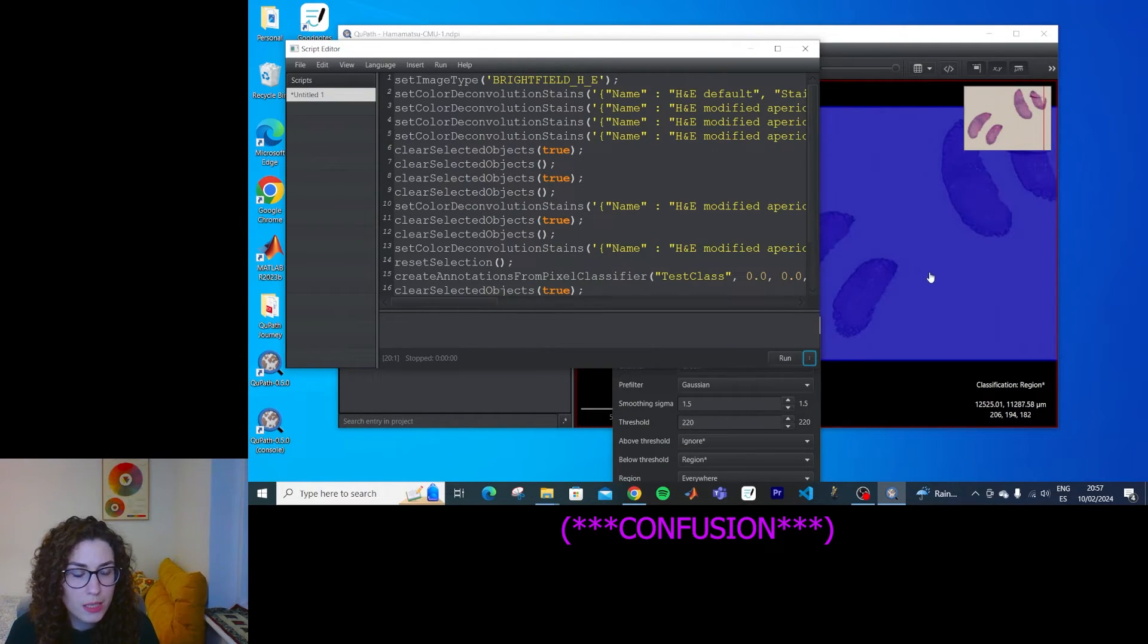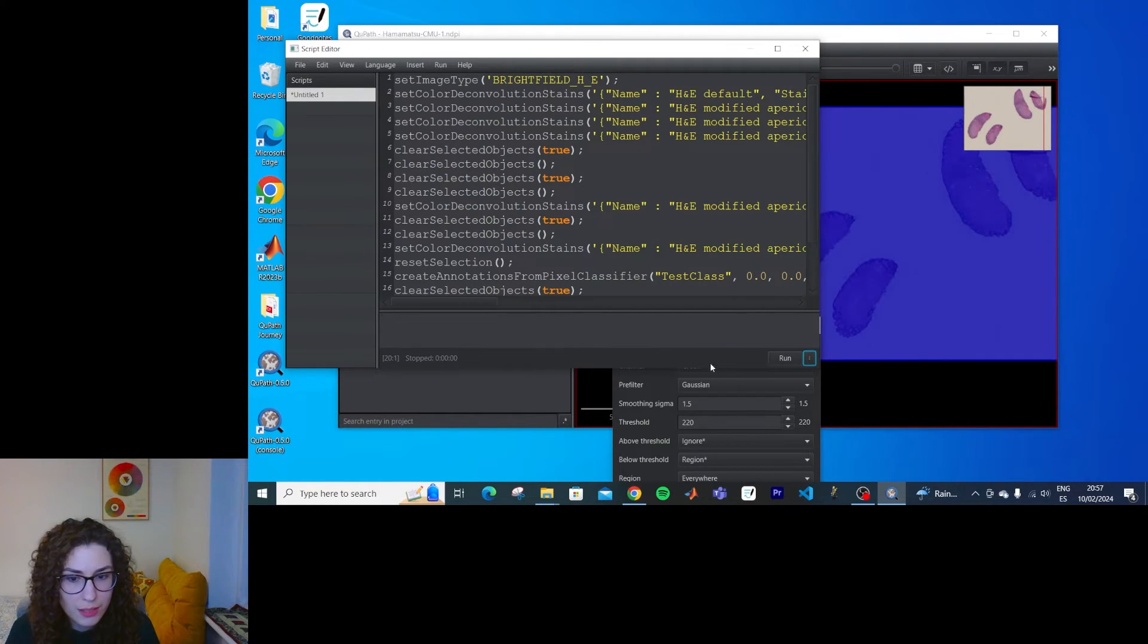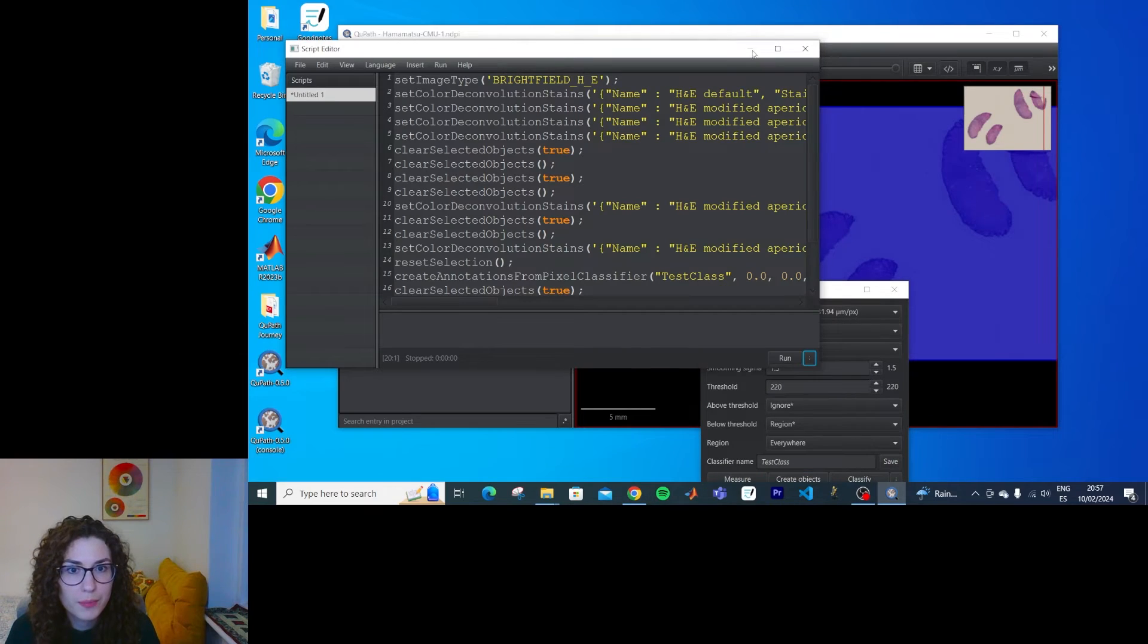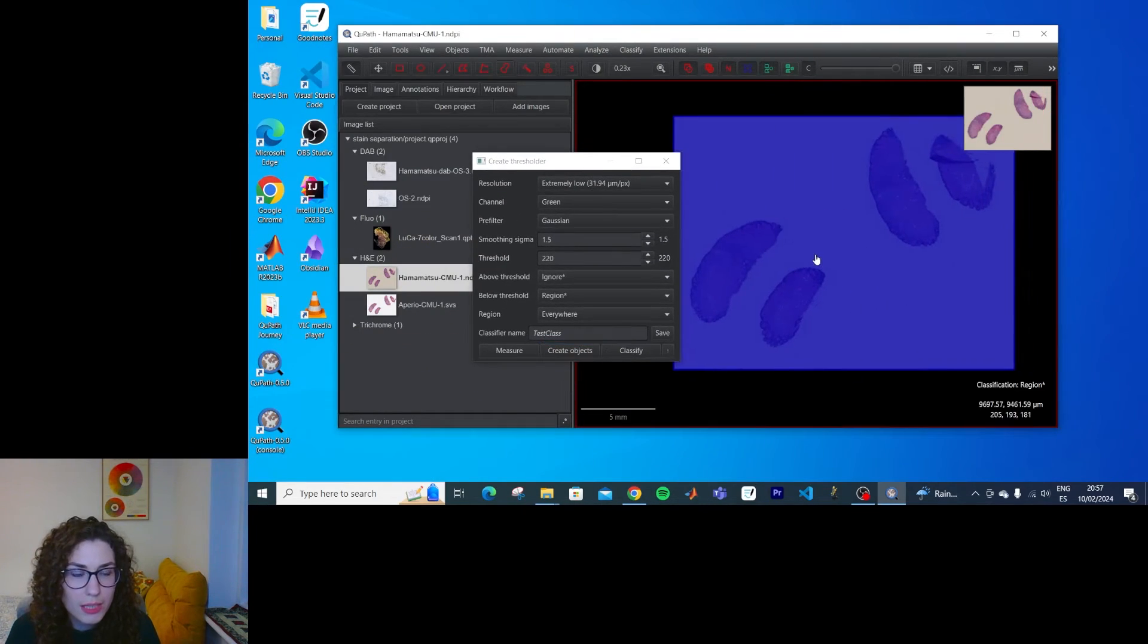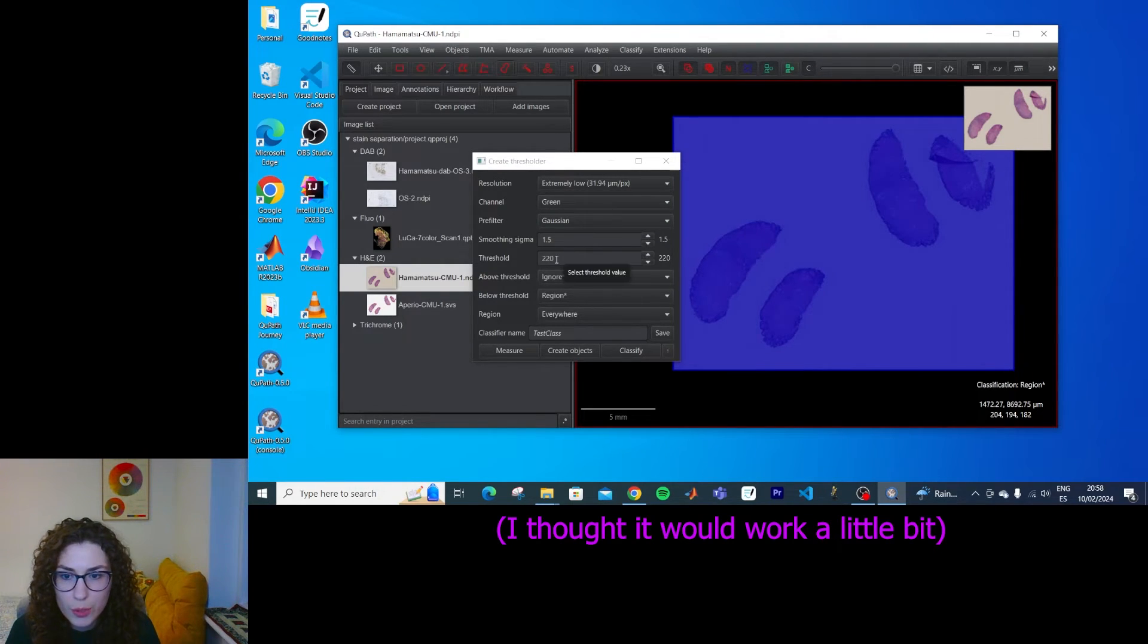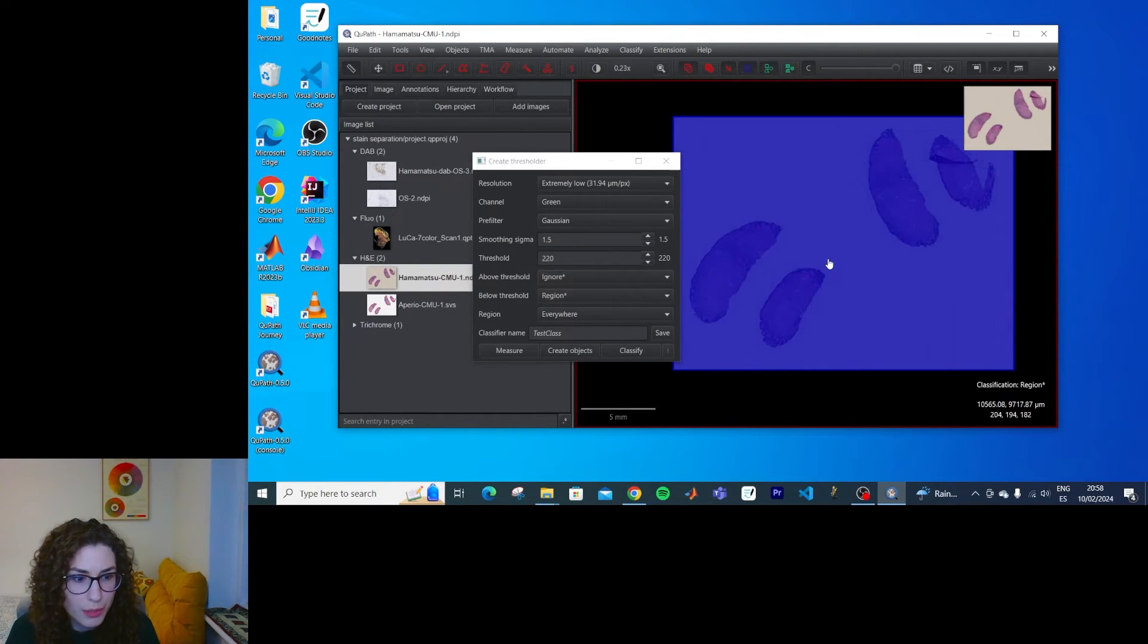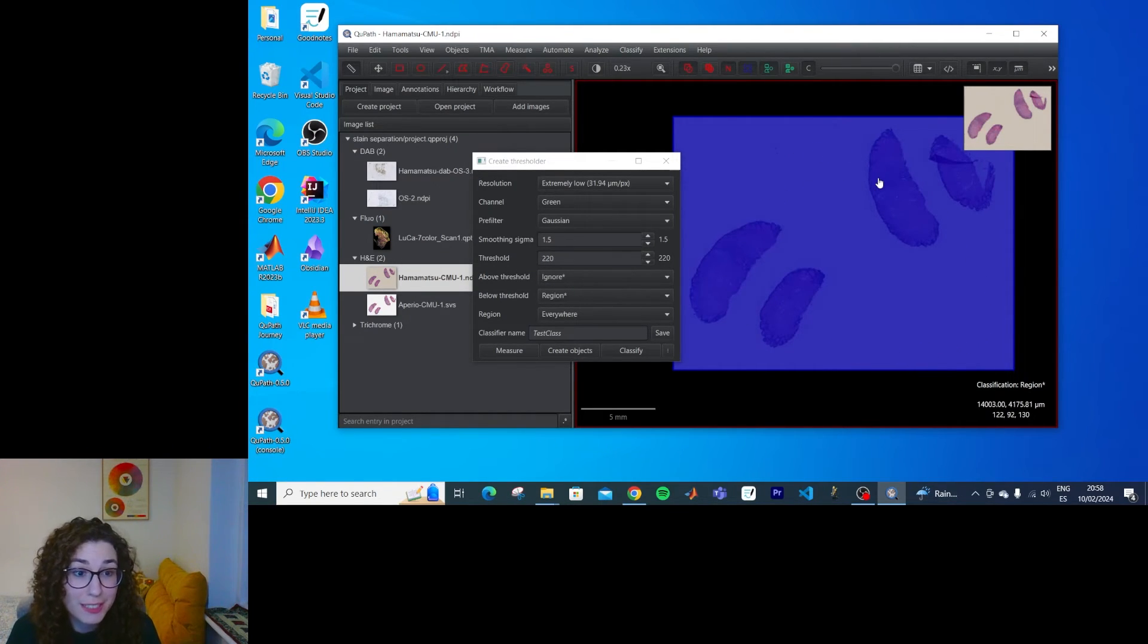And it doesn't work. It doesn't work because I said that doesn't work because I'm saying that the threshold is with the green and 220 value. And region is whatever is below 220. And apparently everything is below 220 in the green channel for this image.